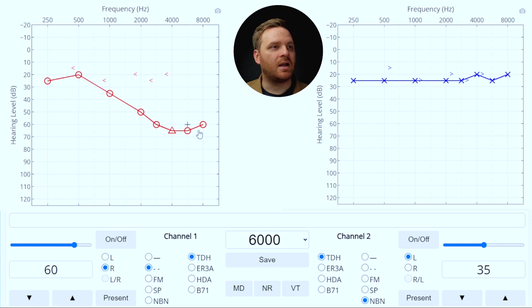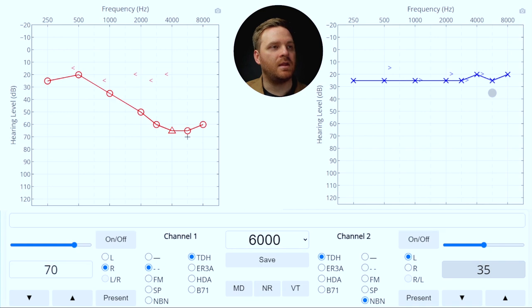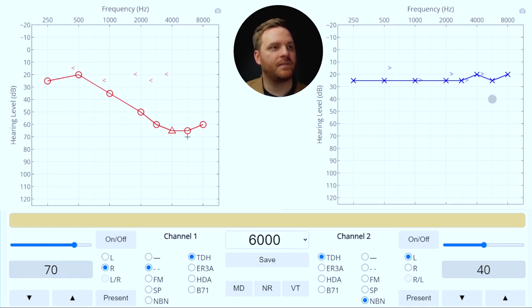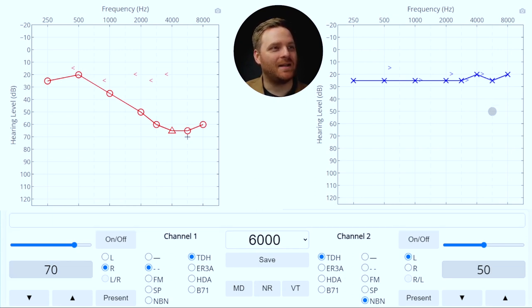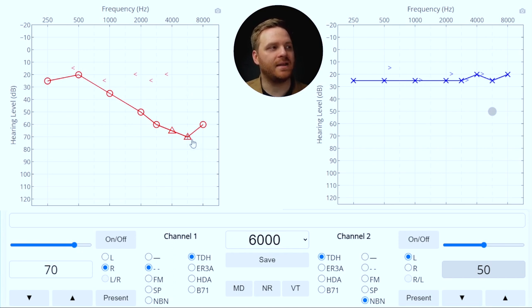Performing masking at 6000 Hz: start at the air conduction threshold of the test ear, turn the masker on at the air conduction threshold of the non-test ear plus 10 dB safety pad plus occlusion effect (negligible at high frequencies). I present the tone, increase the signal, get a response, increase the masker, and continue the plateau method. After saving the threshold, I verify over-masking: a 50 dB HL masker crosses over at 10 dB HL, which is not audible by bone conduction in the right ear. We are not over-masking.